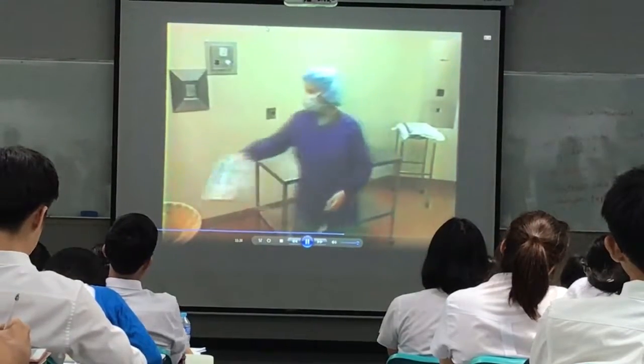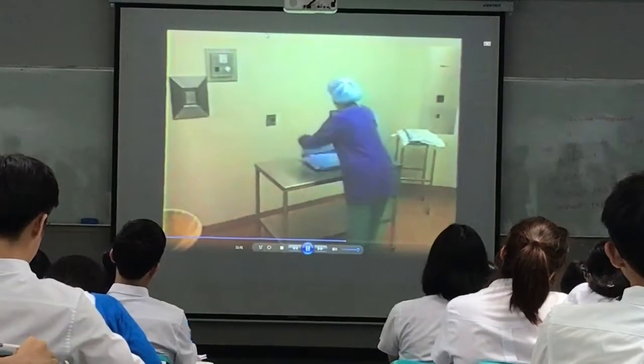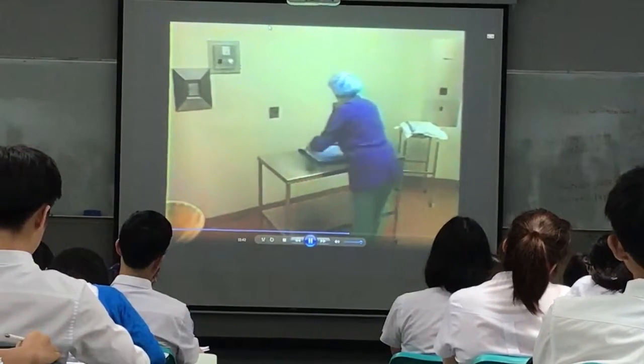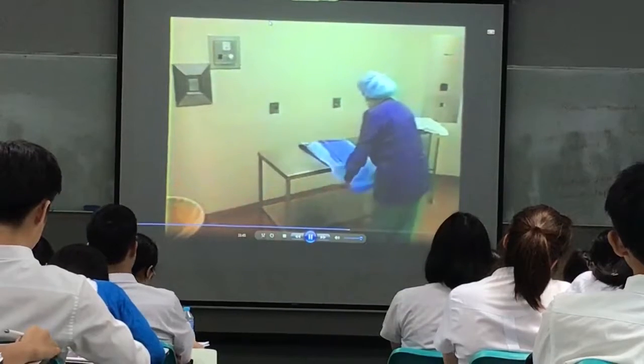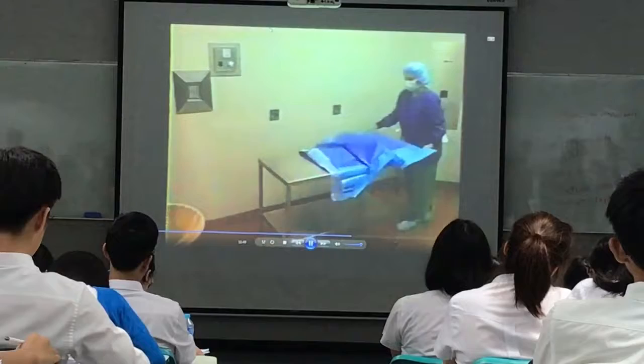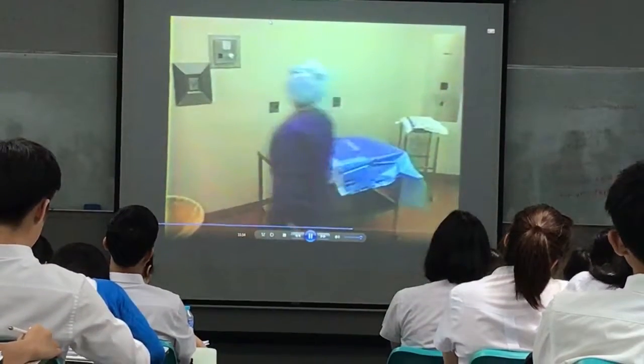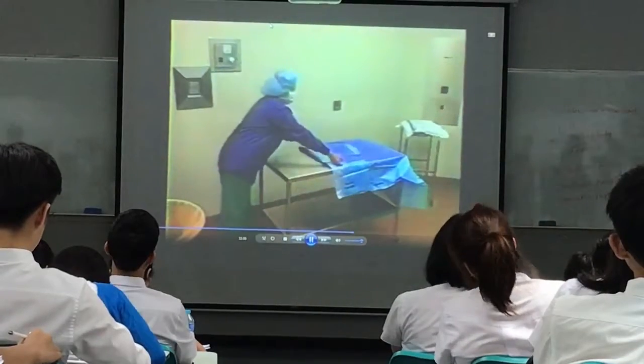With some commercial packs, place your hand under the fold of the material. Open the back, and then the front flap. Each side flap should then be opened. Care should be taken to walk around the pack and not reach over the sterile field.